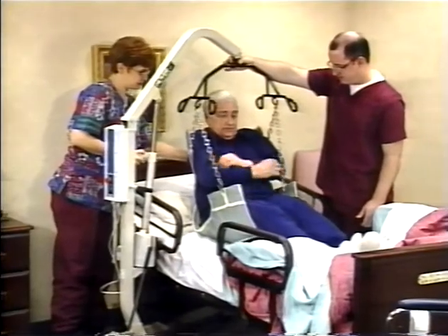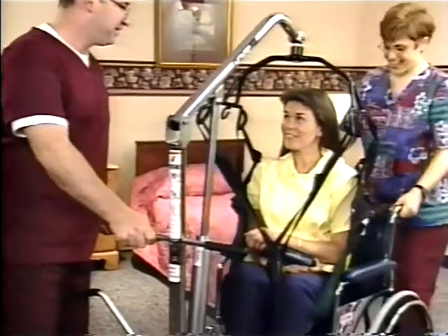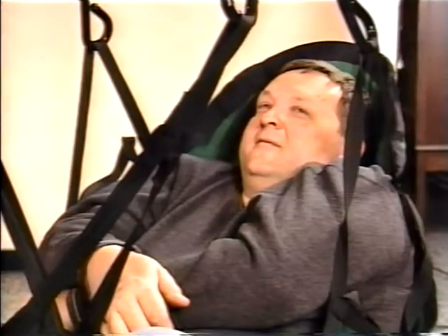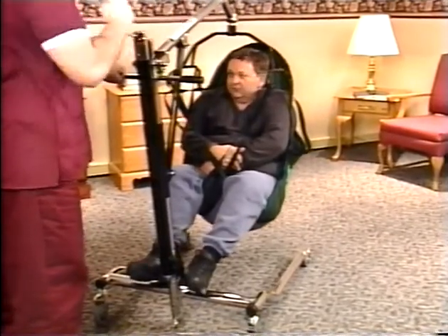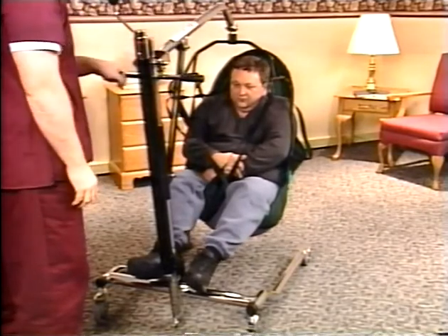Choose a sling according to the patient's size and weight, degree of disability, and the type of lift or transfer you're performing. Adjust the sling to suit your passenger. Slippery garments could cause him to slip out. He should be in a sitting position, facing the caregiver, with his knees slightly higher than his waist. His feet should ride on the base of the lifter, straddling the mast.